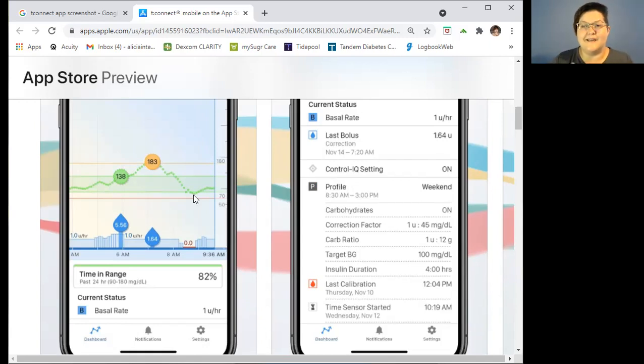The other piece that is really helpful with the app is, again, being able to see what the system's doing and breathing. These hybrid closed loop systems as a whole work best when we let them do what they do. The more we get in there and mess around, throw insulin around, the more the systems become kind of unstable. Then it's what we think we should do versus what the system thinks we should do. We're working against each other, and really both of us are counteracting each other, so we never really make progress. We're frustrated and the system's useless.